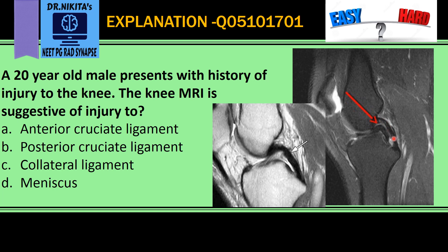Now, if you see in this image in the question, that is the posterior cruciate ligament posteriorly, but anterior to it we see another structure that looks like the posterior cruciate ligament. So it appears as though there are two PCLs — this is called the double PCL sign.